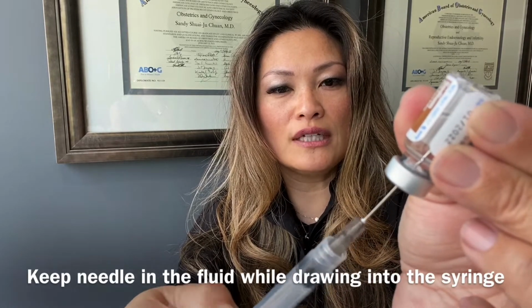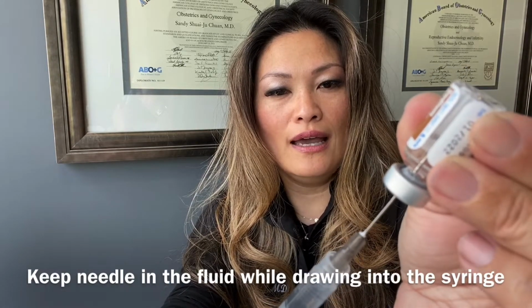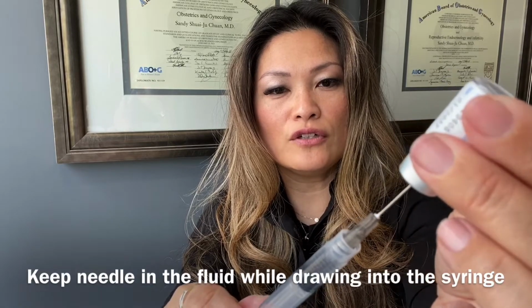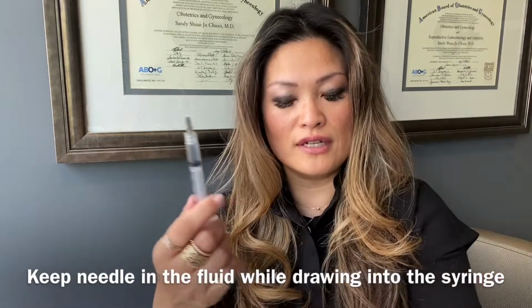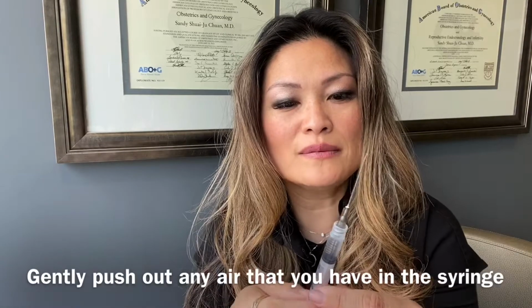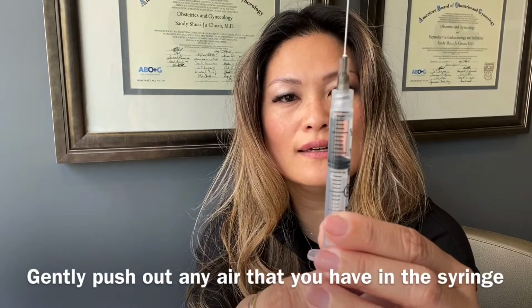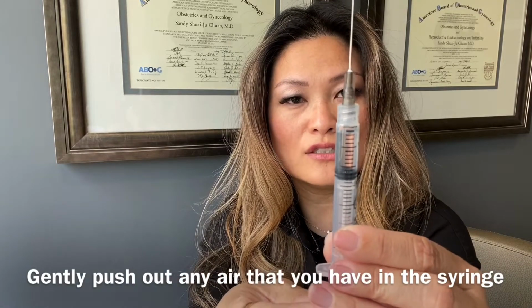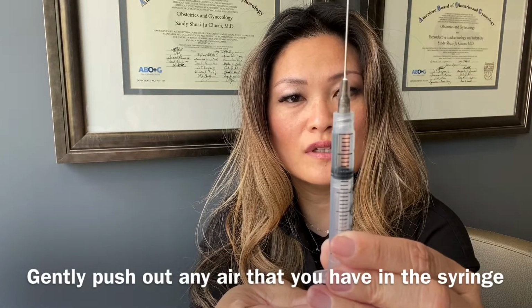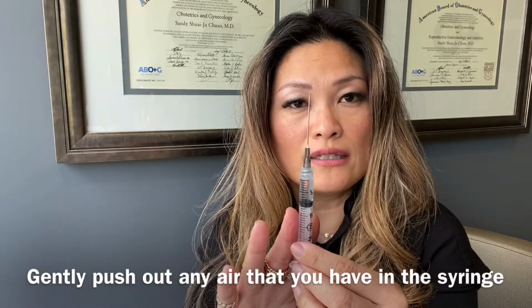So you're going to start pulling, and then you'll look at your mark to the point where it says 1 ml. As you're pulling initially, you're going to feel a little bit of resistance, and that's okay. Just keep pulling, and then you're done. Sometimes, if it's your first time, you might end up getting some air in the top. I didn't, but let's say you had this much air in there. See how that's air? That's not a problem, don't worry. You just gently push it all the way through, and then the air is gone, okay? And now you have your saline ready.